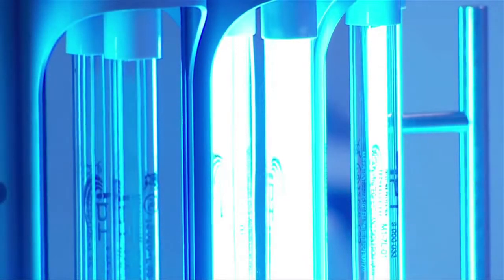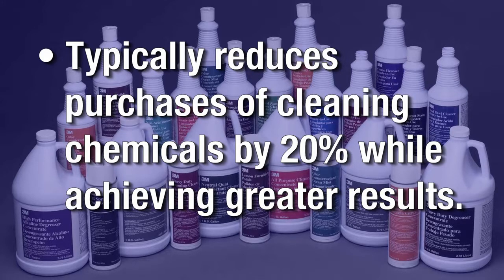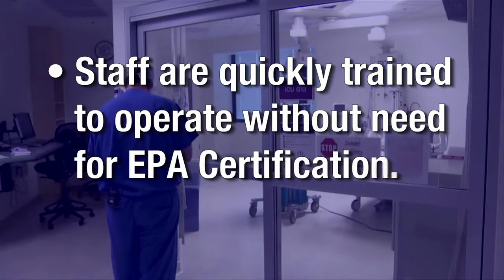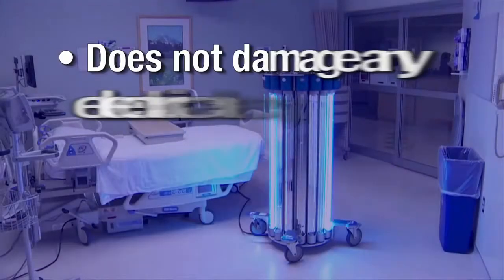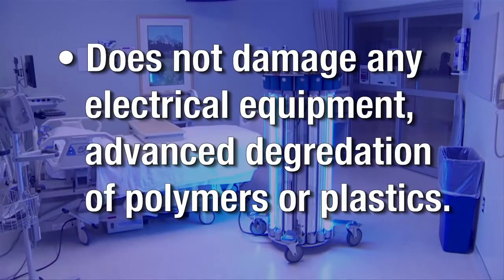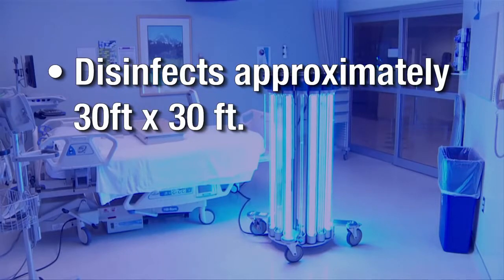Some other benefits of using IRIS are a reduction in the purchase of cleaning chemicals by an average of 20% while achieving greater results. Staff are quickly trained to operate IRIS without the need of EPA certification. IRIS does not damage any electrical equipment or cause advanced degradation of polymers or plastics. One IRIS unit disinfects approximately 30 feet by 30 feet.